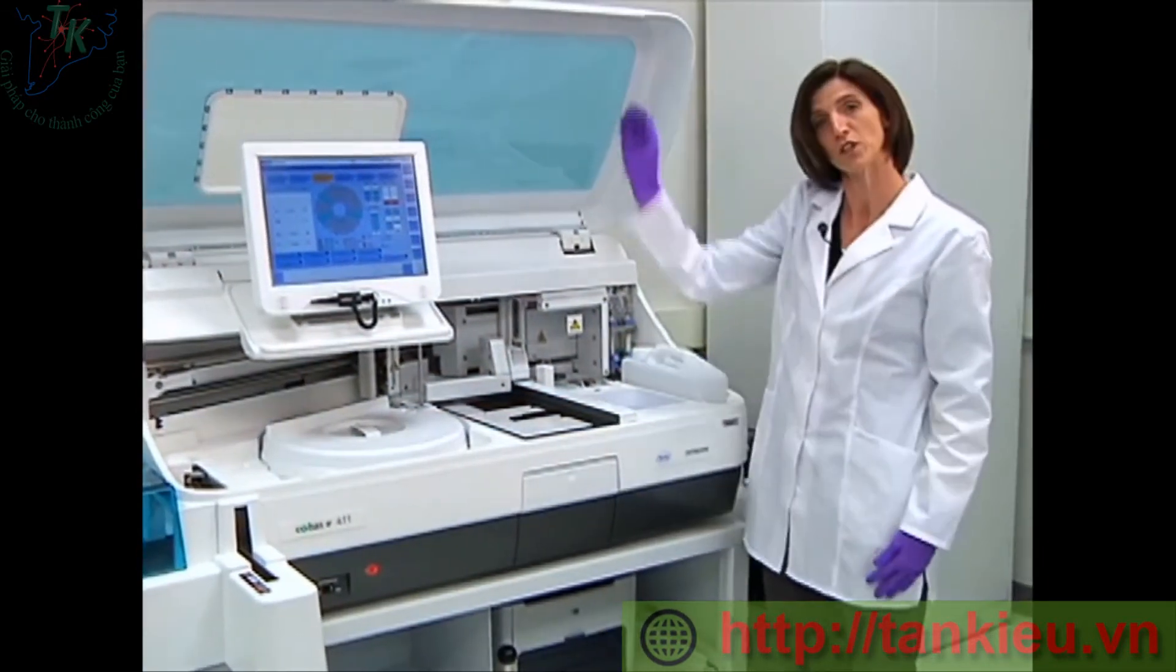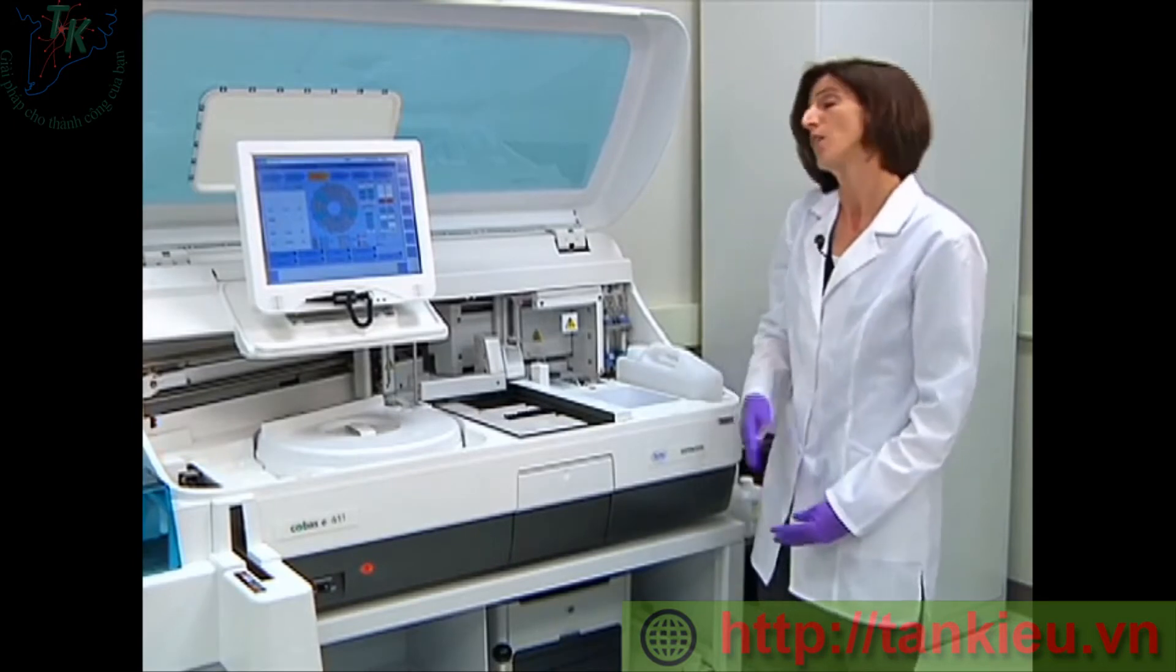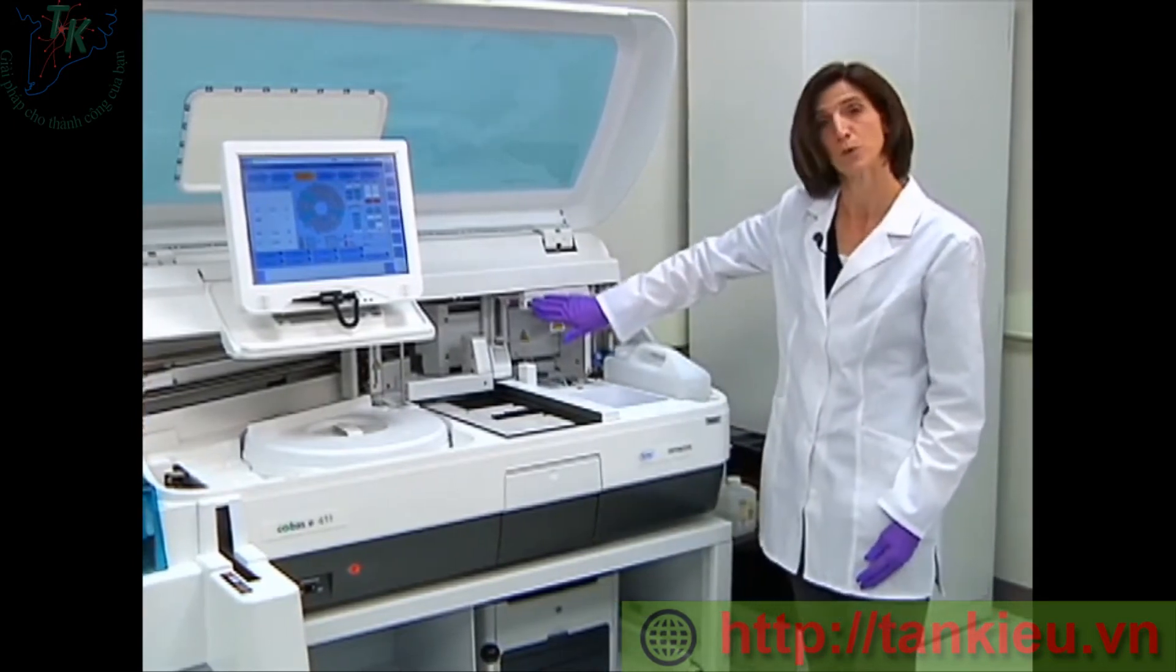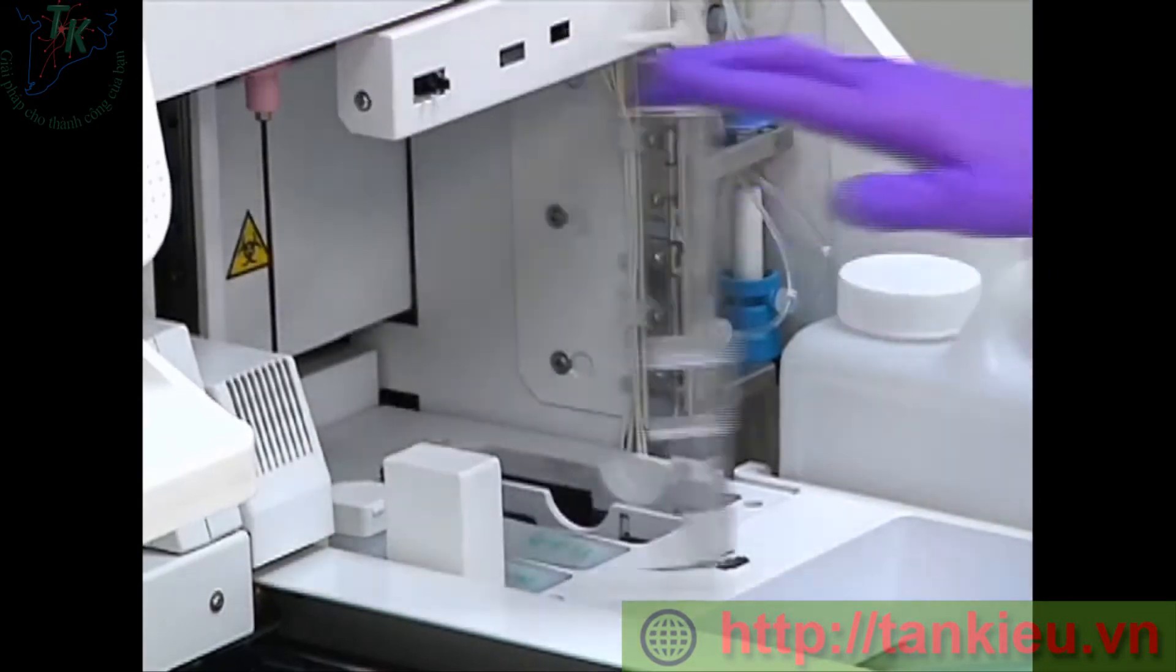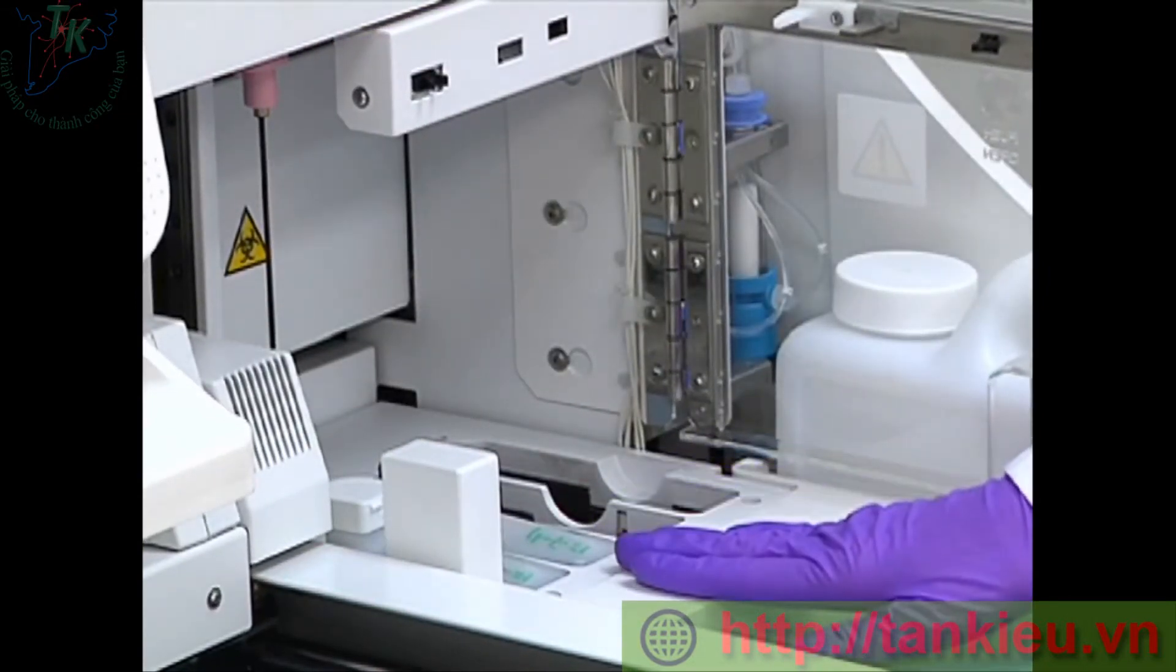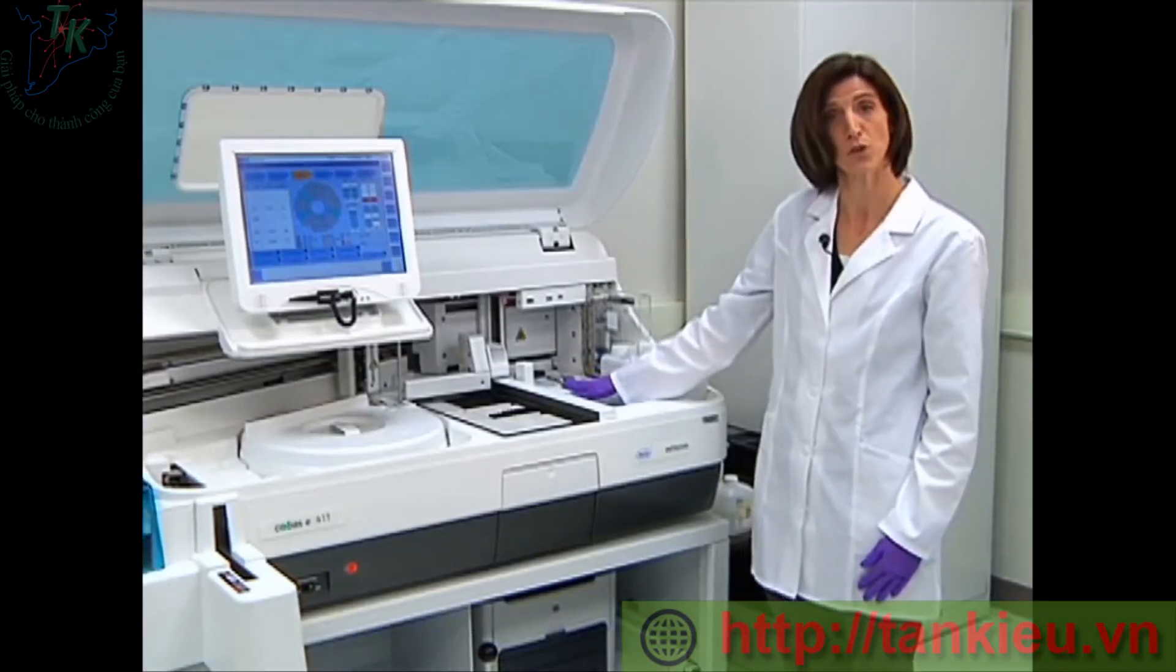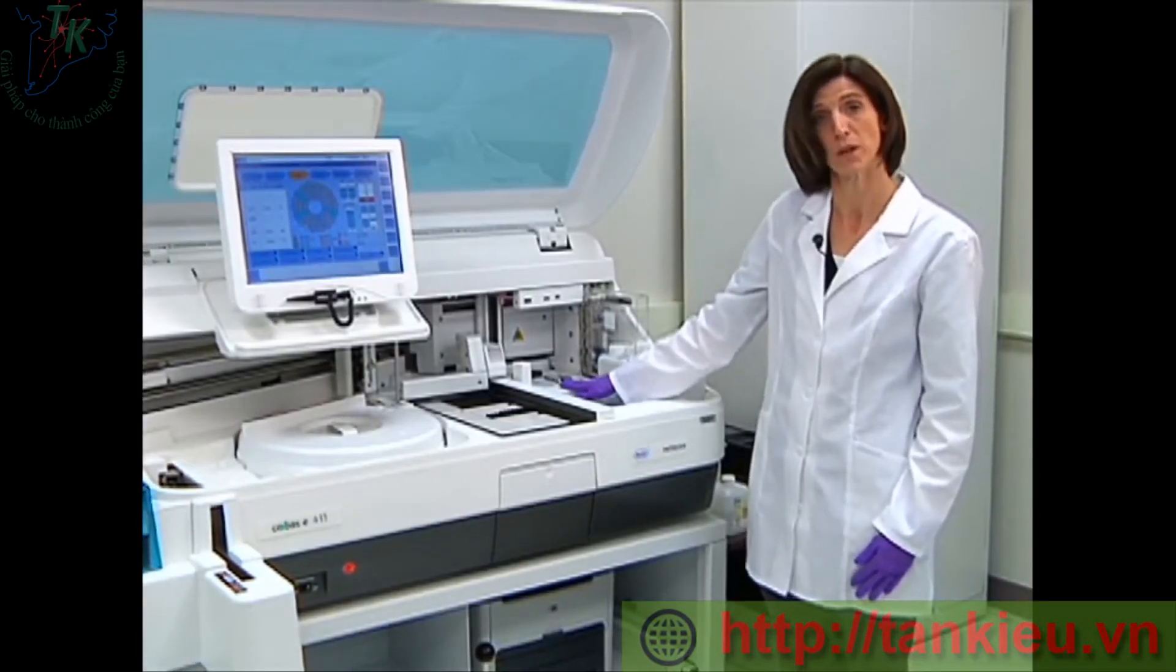The first thing that we're going to load are the system reagents, which are called ProCell and CleanCell. Those reagents are found behind the zipper shield, so we need to open that. And you can see that there can be two sets of ProCell and CleanCell on board. It depends on your lab's volume whether you have two sets on board or maybe just one set.